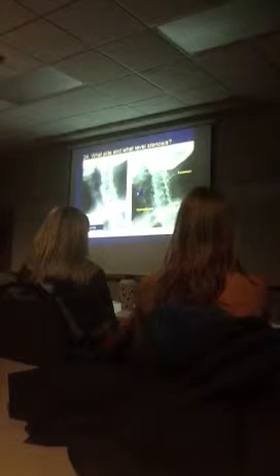So here we have stenosis involving the neuroforamen. Since this is down at the C6-7 level, what nerves would be involved, and where would you test for this? What symptoms would the patient have?